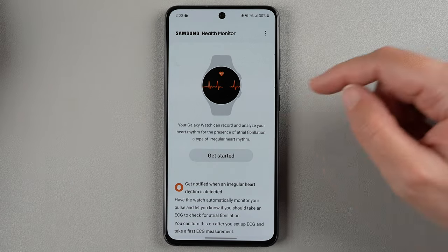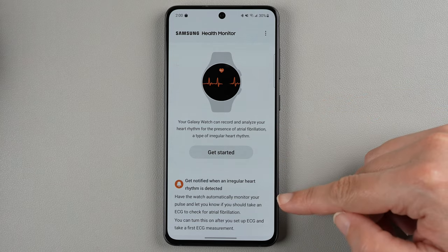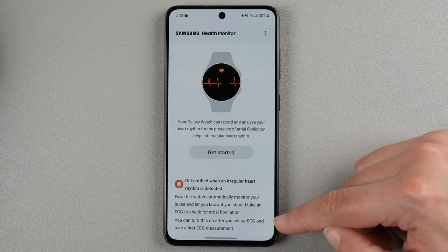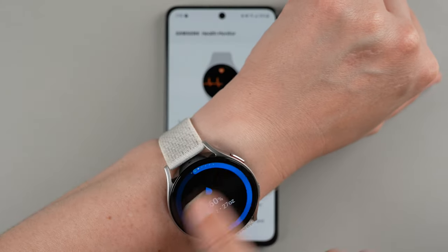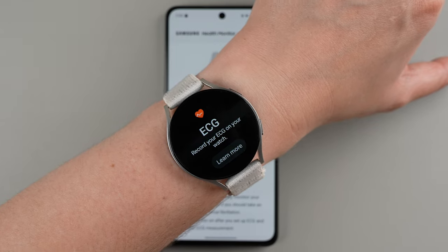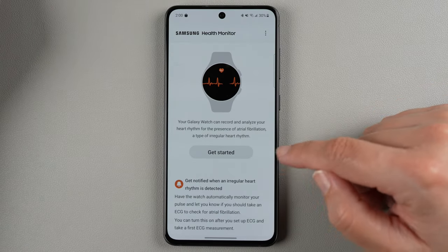Here we're talking about the irregular rhythm feature. It says have the watch automatically monitor your pulse and let you know if you should take an ECG to check for atrial fibrillation. You can turn this on after you set up ECG and take a first ECG measurement. So it's still showing that on the watch, meaning it's not set up yet — we're still in the phone. I'm going to go ahead and tap get started.